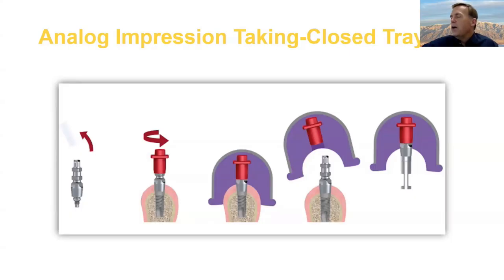Now, I know there's going to be times where the patient can't open enough, or you need to use these components, so be it. And most of us laboratories realize how important this is, and there's like 1 or 2 people in the building who do this, so that we don't get just any old person sticking parts in the impression. This is one of those steps that's really, really important. But you can see that this process is intrinsically less accurate than open tray.